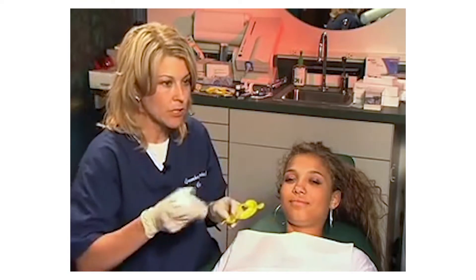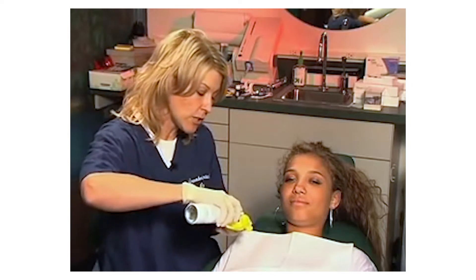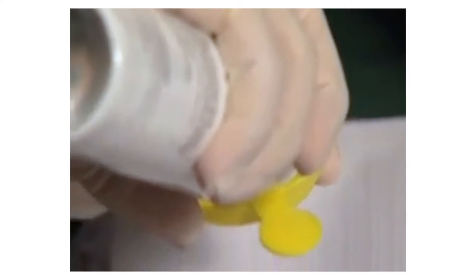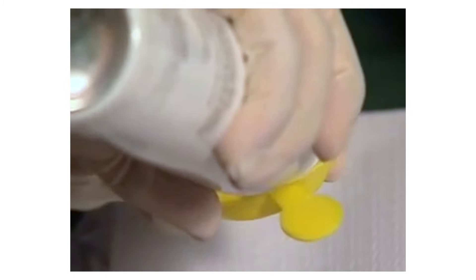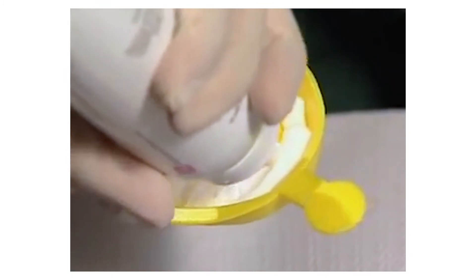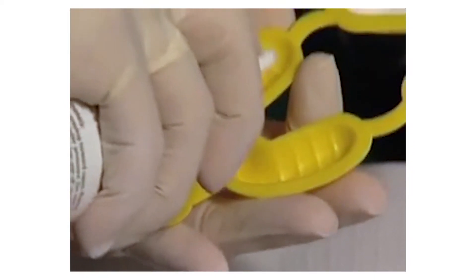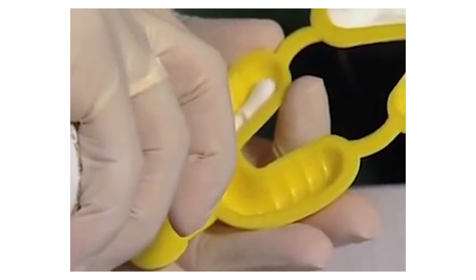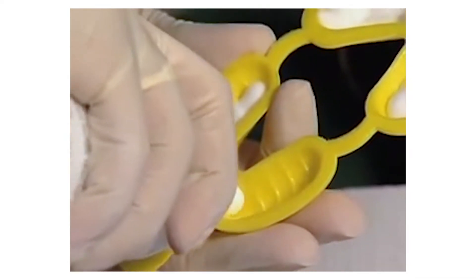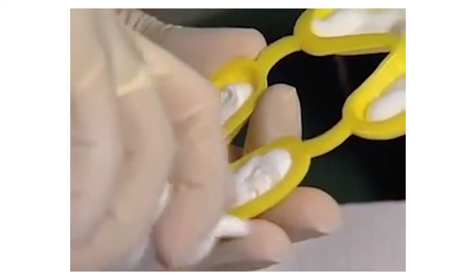I'm going to shake it really good, and then just load it a little bit. I'm just going to squeeze it out — you'll notice I'm using just a little bit because it really is going to foam up. I'll go one time around and follow that back, then do that again for the lower. Notice it's foamy — I don't want to overdo it.